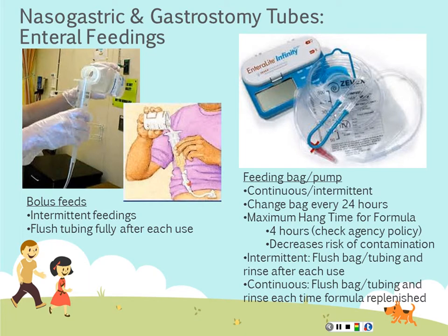So you always want to give about 30 mils, fill the tube up halfway, let it go down, and then fill it up some more. And you want to make sure you're flushing that tubing fully after each use.